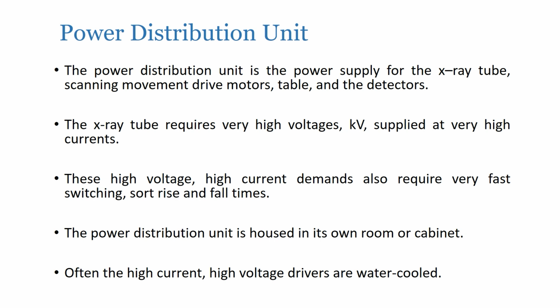Another is the power distribution unit. The power distribution unit is the power supply for the X-ray tube, the scanning movement, the drive motor, the table and the detector. The X-ray tube requires a very high voltage, high kVp, and is supplied at a very high current.